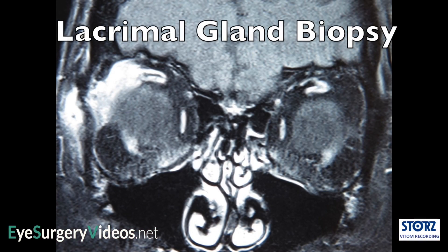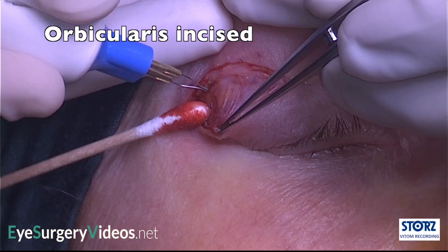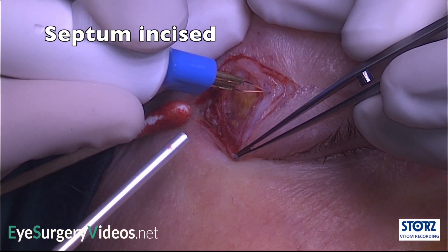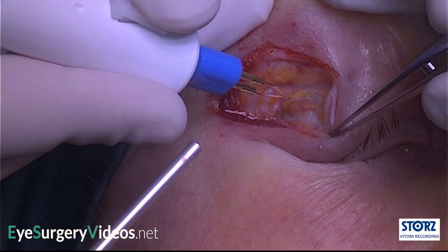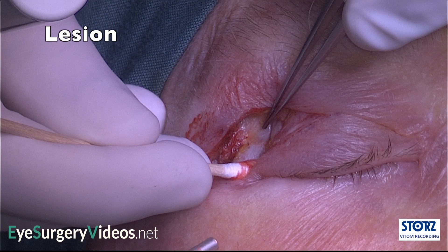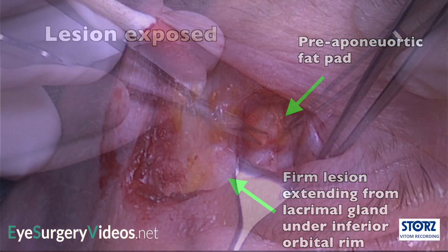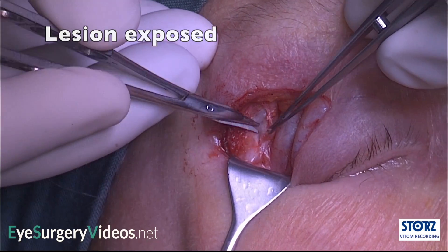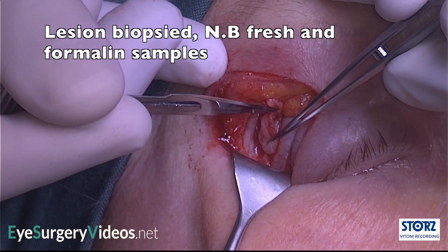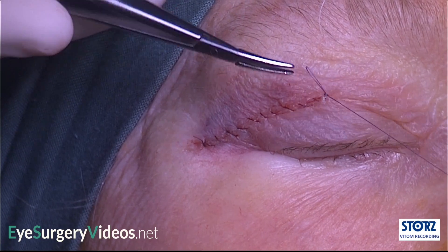This patient has a superlateral orbital mass involving the lacrimal gland. A skin incision is made, and orbicularis and septum are then transected using a hotwire. This reveals a lesion extending from the lacrimal gland to the inferior aspect of the superior orbital rim. The lesion of interest is then gradually exposed and biopsied and sent for histological examination. The skin crease incision is then closed with a running vicryl suture.